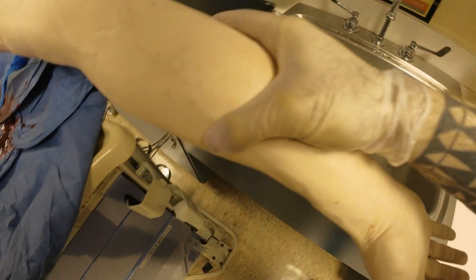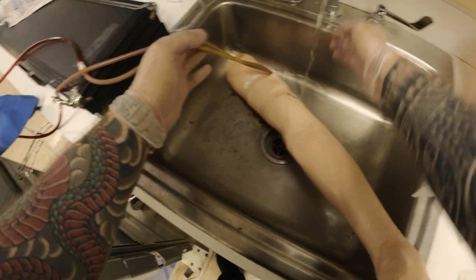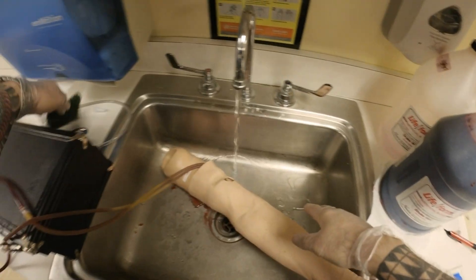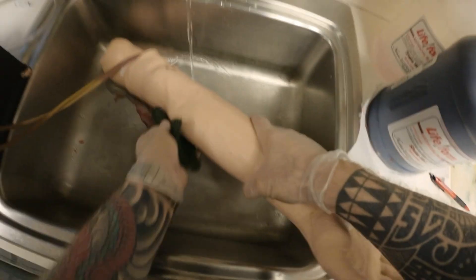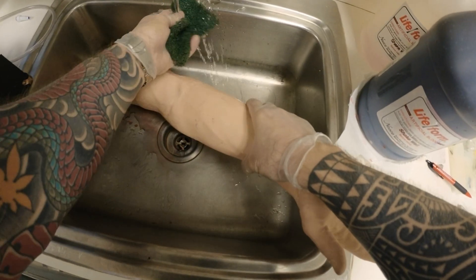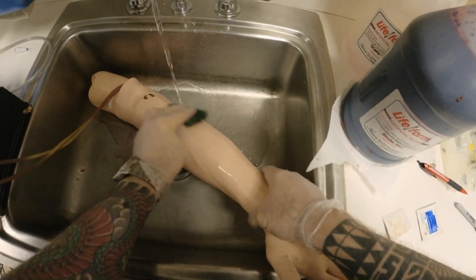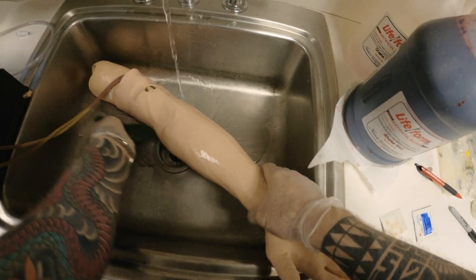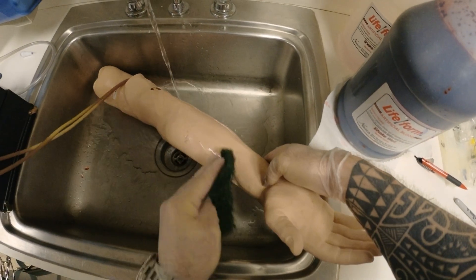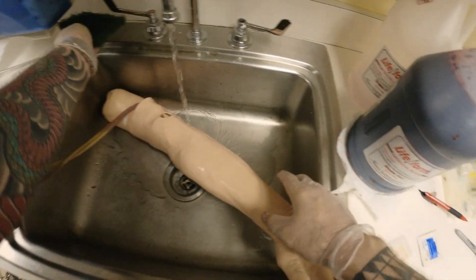Then what I do is I take this arm, put it in the sink, and if you have any blood on it you can take a sponge, water it, and clean it. So now my arm is clean.